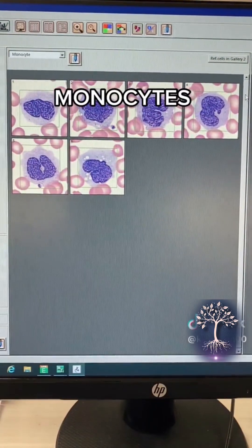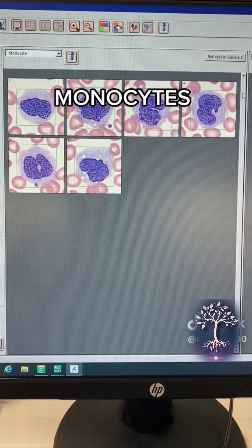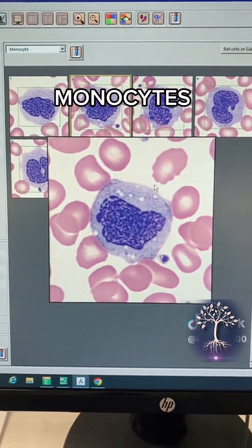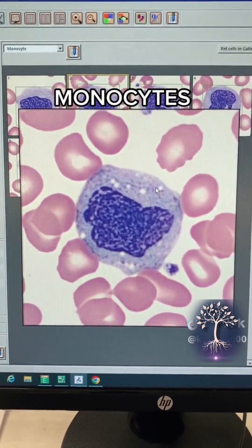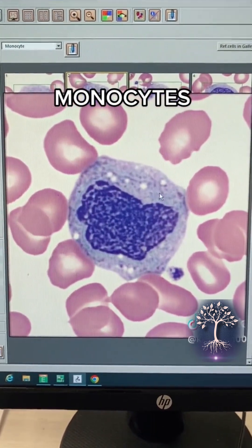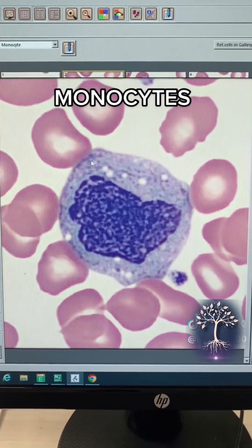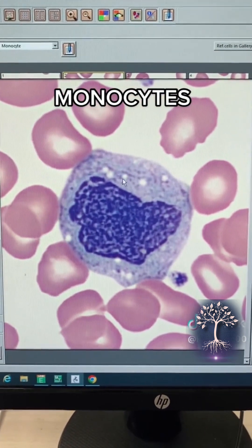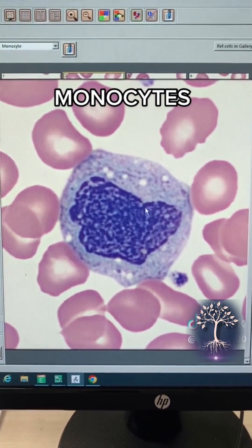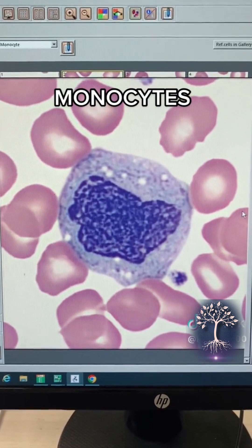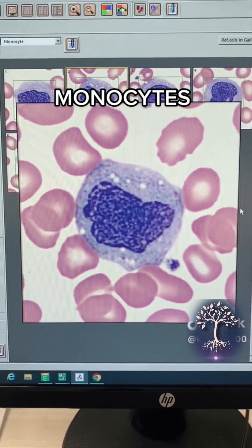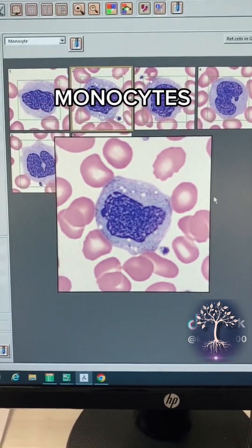And then last but not least we have your monocytes. Your monocytes are your largest of the white blood cells. They have a blue-gray, kind of glassy cytoplasm and then the nucleus is sometimes oddly shaped. You can see sometimes it looks like this and then sometimes it has different shapes, as you guys can see in the background here.